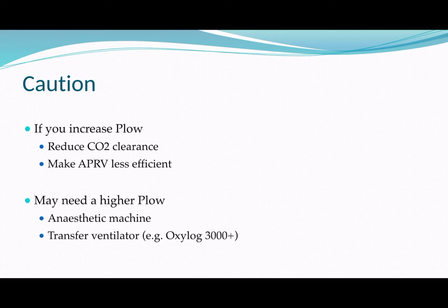And so always check what's been set. You'll be surprised how often people just fiddle with the ventilator when you walk off, and therefore make things worse. And it will make APRV less efficient, especially for CO2 clearance.